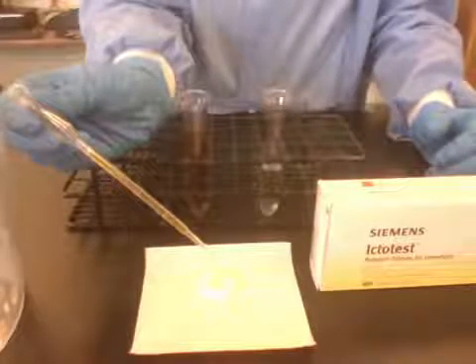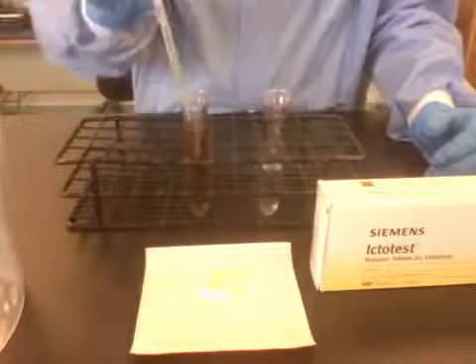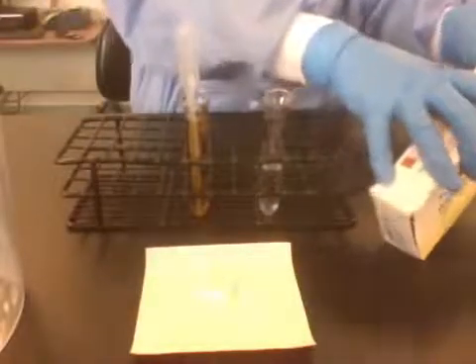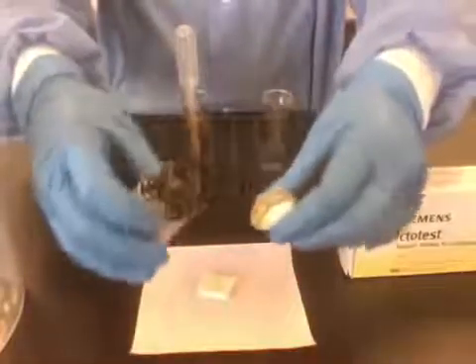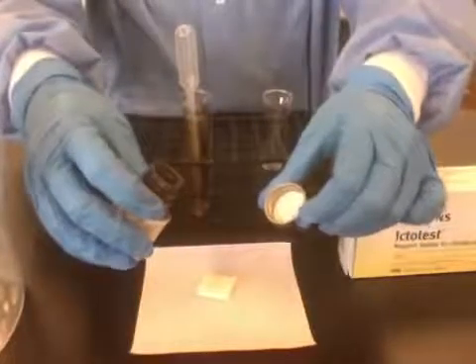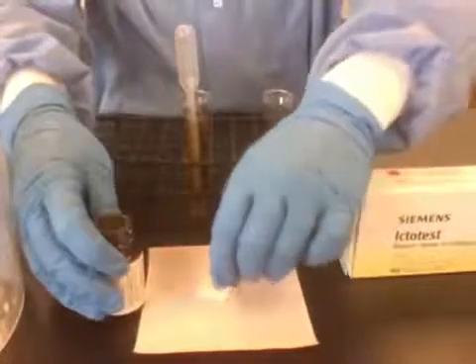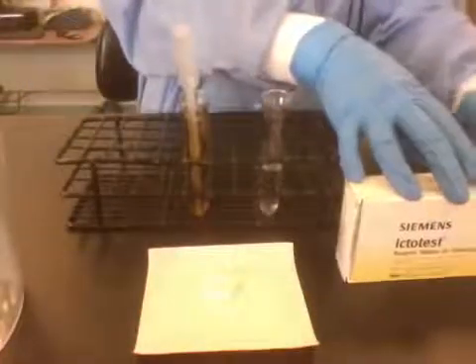One, two, three — counting out the drops. Then you're going to add the Ictotest tablet. I'm going to shake the tablet off into the lid first, not onto my gloves. You should not touch these tablets. And then I'm going to gently, carefully place the tablet onto the pad. Replace the top of the vial.